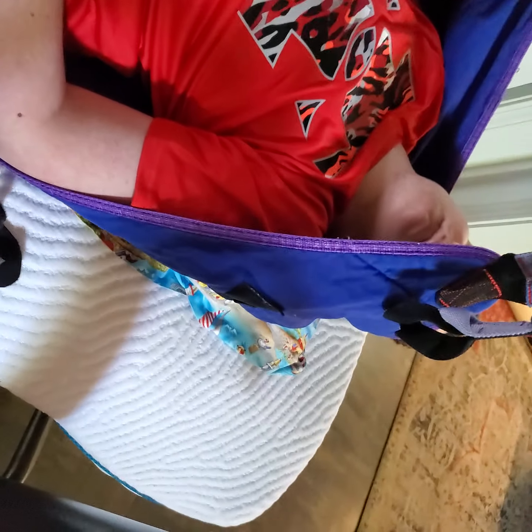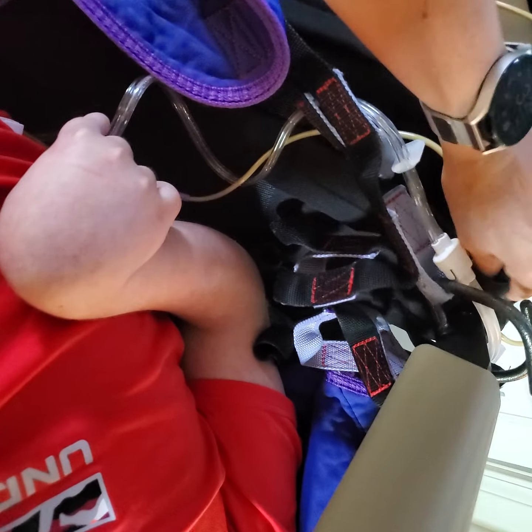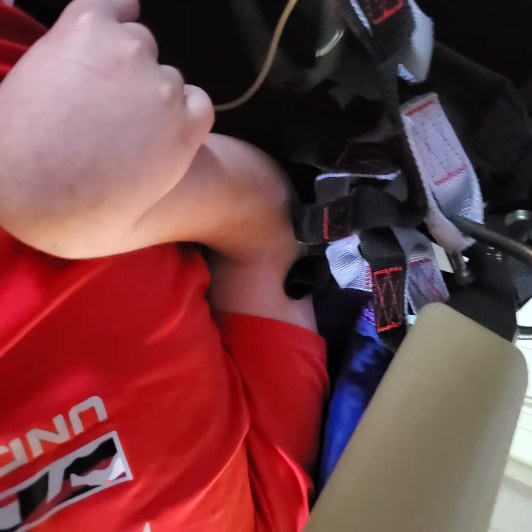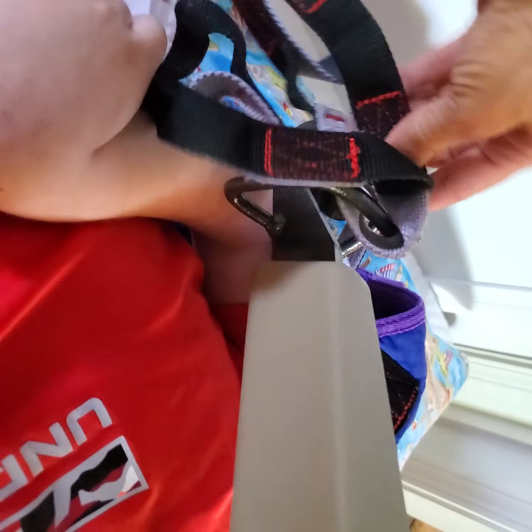And there we go. All right, and then we start taking the loops off. I would also advise relocking it, otherwise it'll go all the way to the ground. So then we start removing the loops. So the loops are removed. Also remove the feed bag and the cord, so just unhook them from the hooks. Okay, and I normally just put the feed bag down here at the end, and I put his wound vac back up here by the fish tank. Okay, and then finish getting the loops out.